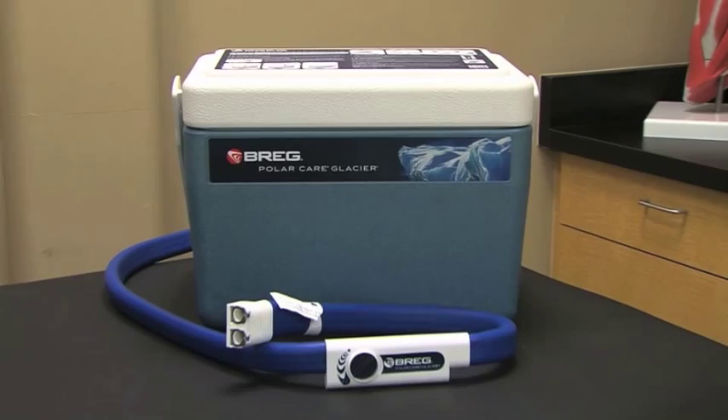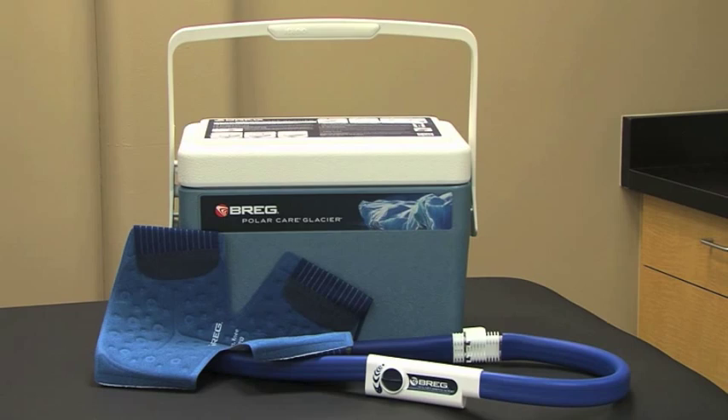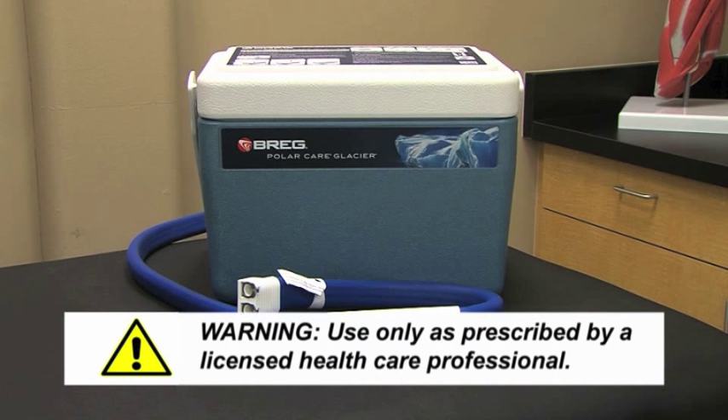This is PolarCare Glacier, designed with the specific needs of the hospital in mind. This motorized cold therapy system's extra-long ice time means it only has to be filled once per shift. 8-hour shift? 12-hour shift? The Glacier has them covered.